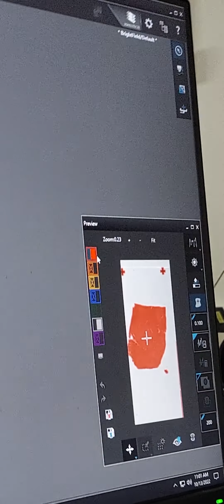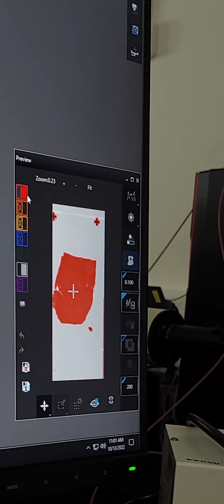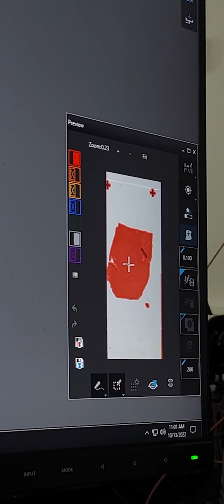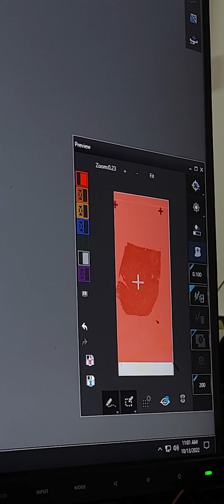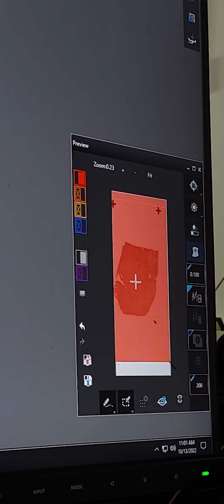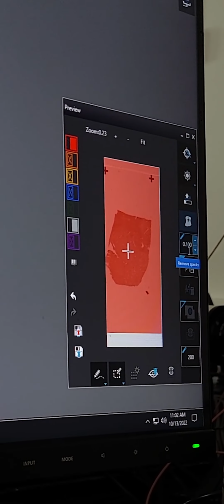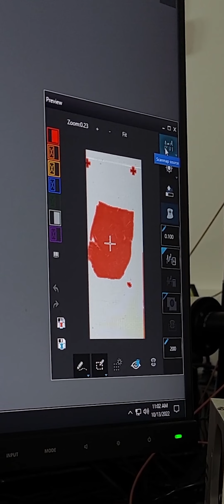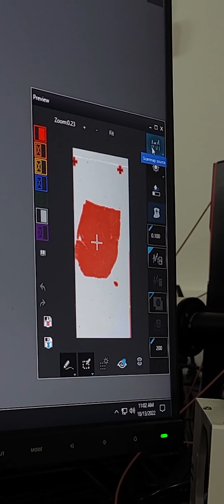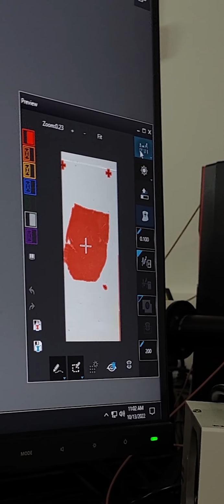But within the preview window, you can also set up which area of this slide I want to image. Because of course, as this is a scanner, you can say it's not a problem, I want to scan the whole slide, all of it. But in most cases, this is not what is happening. Because time is precious, you only want to image the sample, and for this we have many kinds of tools. It is actually a very important step before scanning, how to choose the area that is going to be scanned.